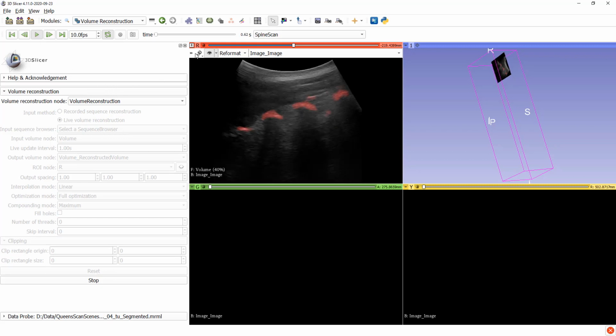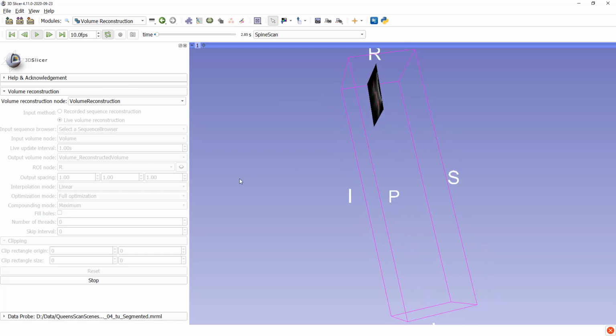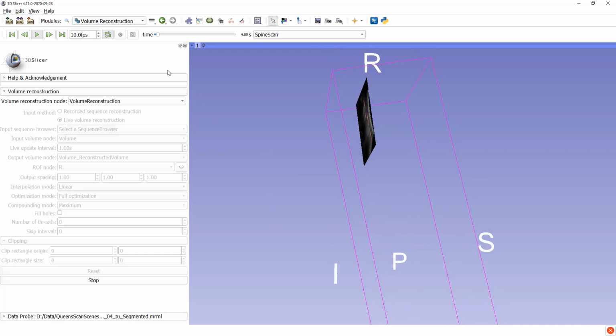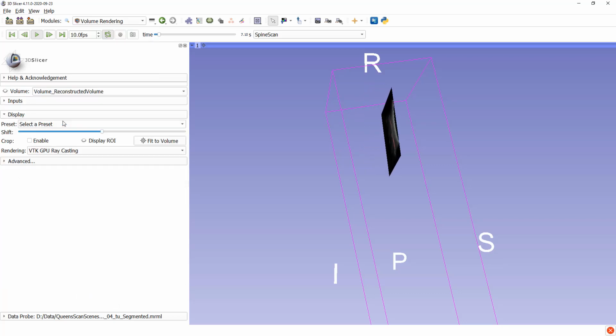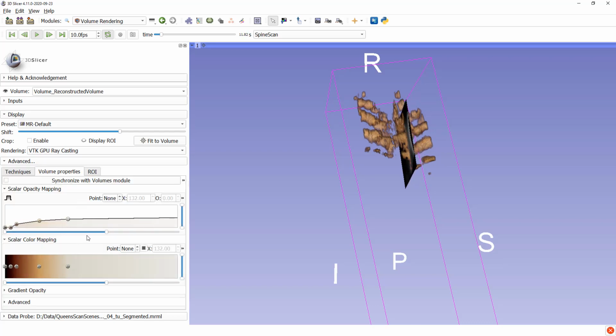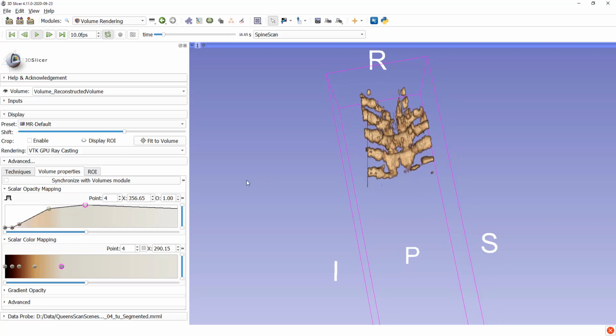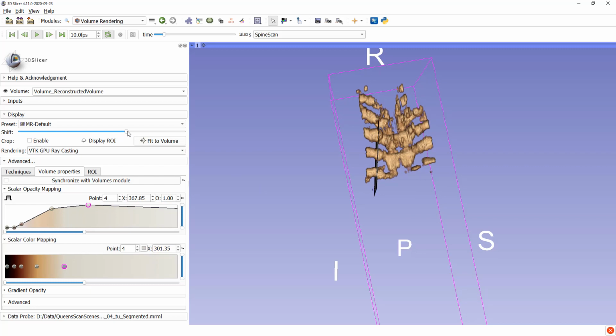So now, when we replay this ultrasound recording, the volume reconstruction module is reconstructing a 3D volume in real time as new ultrasound images and new prediction images are being generated. We are using the prediction image as the input for volume reconstruction. So when we visualize the reconstructed volume, this is not the original ultrasound, but this is the 3D reconstruction of the bone prediction images, where we, of course, apply the same tracking information that we had for the original ultrasound images. We can use the same volume reconstruction options and parameters that are available for CT or MRI in 3D Slicer.